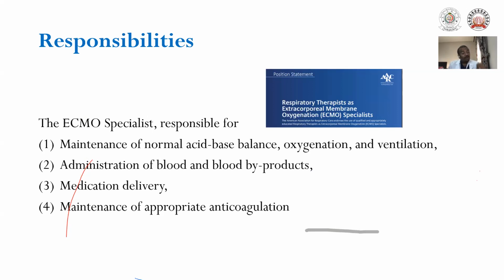They are administering the blood. For that, you need to know the technique, and you have the nurse to assist you in administration of blood. You should be the one guiding or getting the order for adequate volume, because you are the one who is maintaining the circulation. You should know when it is going down and when it is going up, so you need to maintain it. You need to have a medication delivery idea, because you don't have other IV lines available. Sometimes you may, but you can inject your medicines into the circulation because it's directly going into the circulation. That's what the infusion ports are required for. For maintenance of appropriate anticoagulation, you need to check the ACT, as I mentioned, at frequent intervals, and also the blood gas values in a very frequent manner.